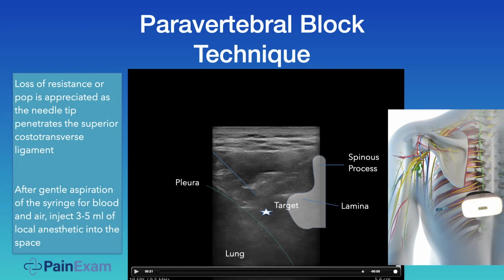You're getting the nerve as it branches out into the medial branch, so even for axial symptoms, you'll get a lot of relief. I've even been able to treat visceral pain of the pancreas by doing a paravertebral nerve block on a patient. It didn't last so long, but I had a patient in my office with pancreatic cancer pain who needed an acute shot. I didn't feel comfortable doing a celiac plexus block with ultrasound in my office. So I did the paravertebral at T8 or so, and the patient had relief. It lasted a week or so.